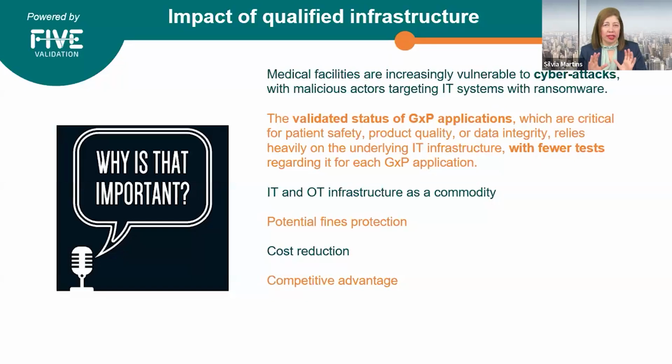So medical facilities are increasingly vulnerable to cyber attacks, with malicious actors targeting IT systems with ransomware. Unlike other network devices, medical equipment traditionally lacks robust security measures, making it an easier target for hackers seeking access to entire server sets. Breaching such equipment not only allows hackers to compromise or disrupt other devices, but also creates avenues for potential breaches of patient data.